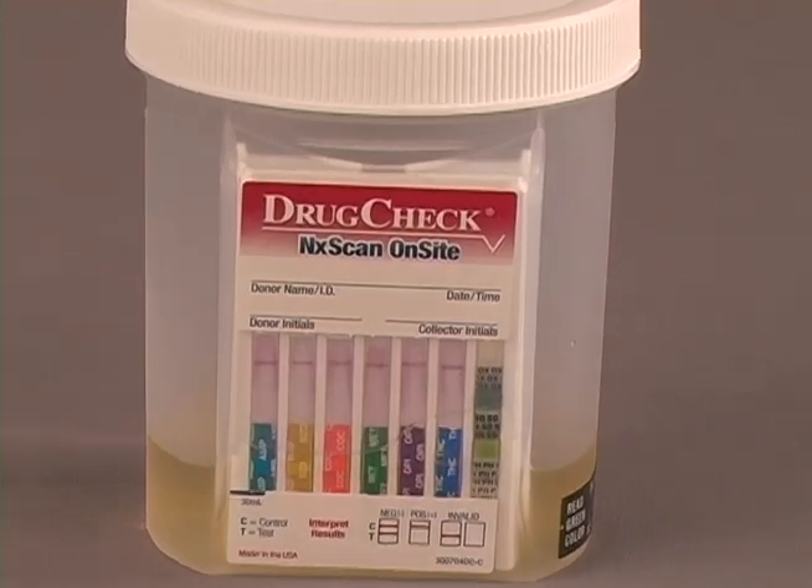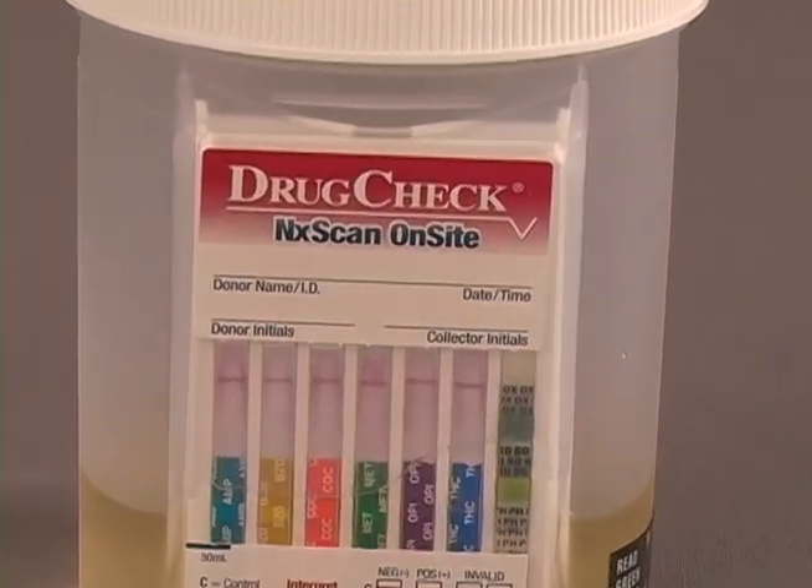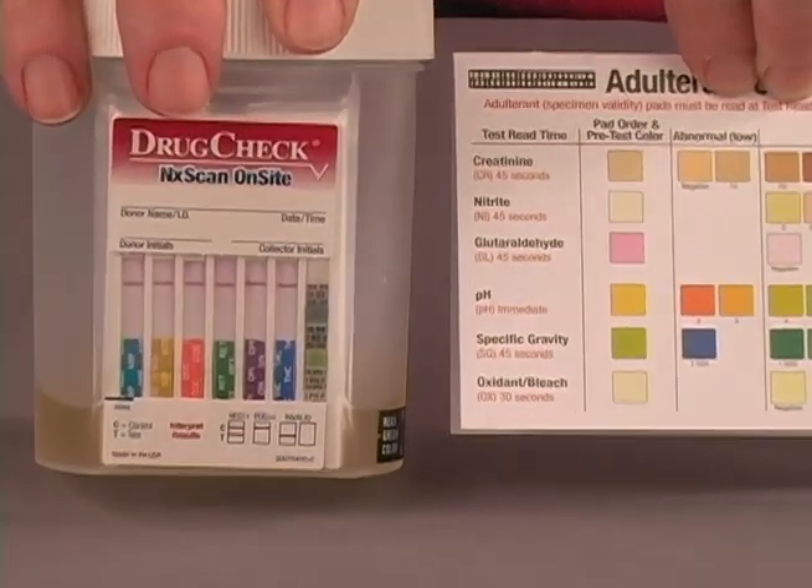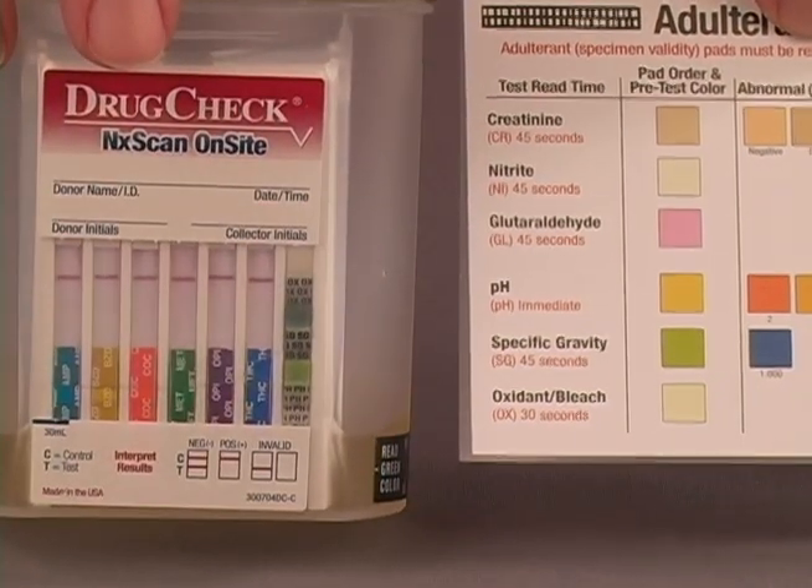The test strips begin to wick up the urine. Compare the color pads of optional adulteration test strips to the provided color chart.